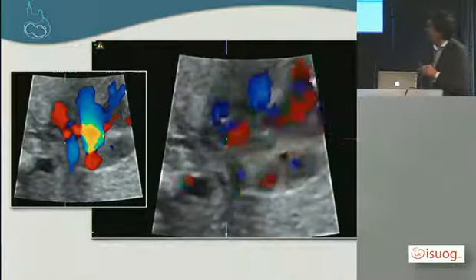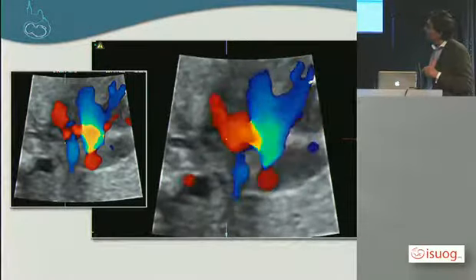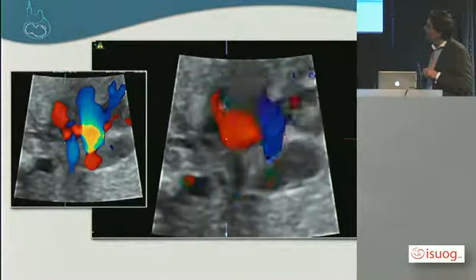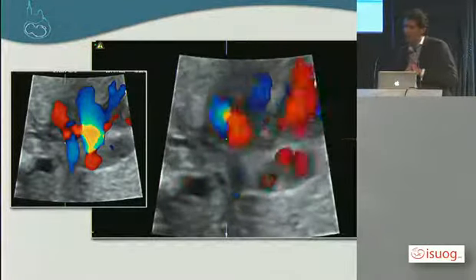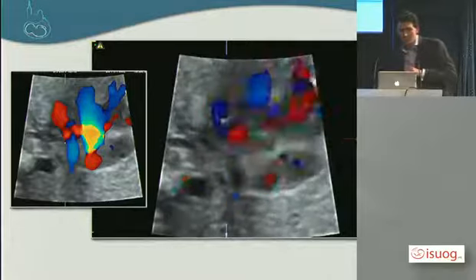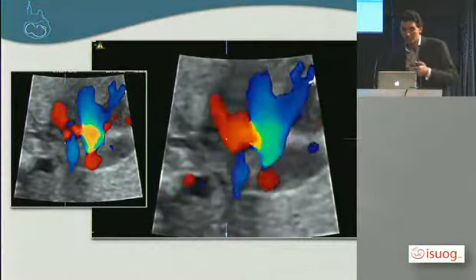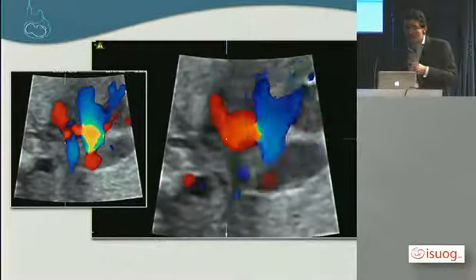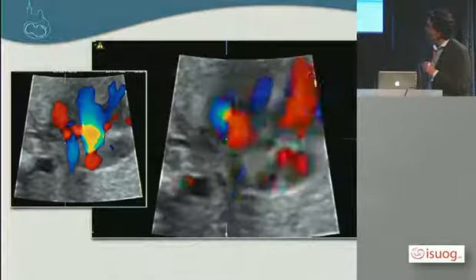And then here, for example, is very interesting because we can see what can add a very relevant piece of information concerning this malformation. What we have to show is how the pulmonary artery looks, the main pulmonary artery, the main pulmonary branches, and then whether there is backward, forward, or anterograde flow within the ductus arteriosus.